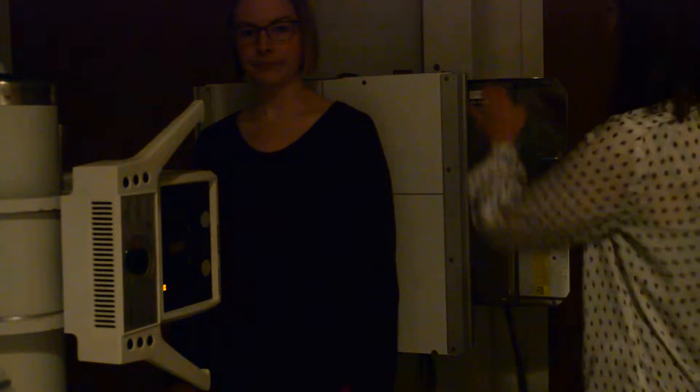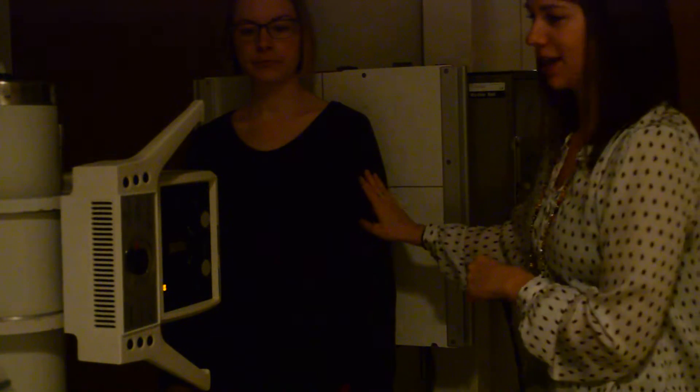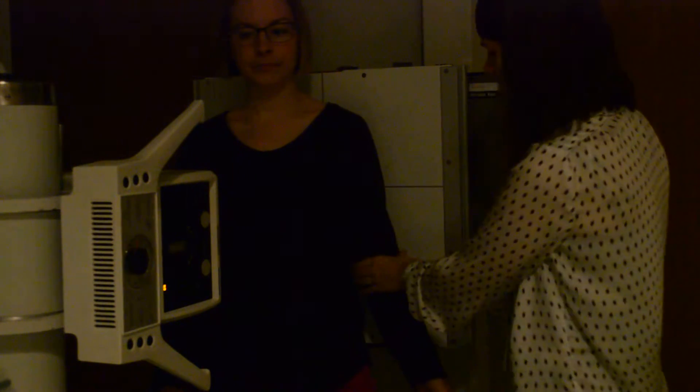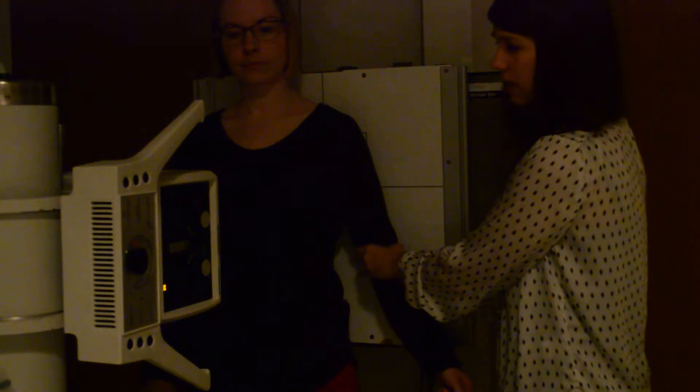We'll start with an AP humerus. For this, you want to make sure that the top of the cassette is going to be above your patient's shoulder. We're going to do her left humerus. True AP is going to be in external rotation. The key thing you're going to want to palpate here are the epicondyles of the humerus and make sure that they are parallel to the IR.